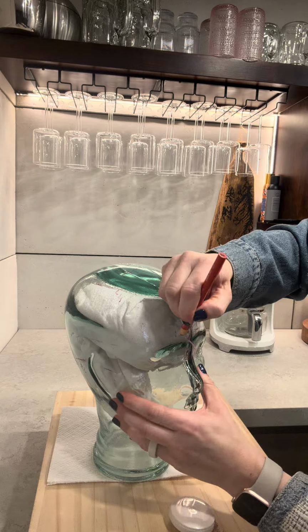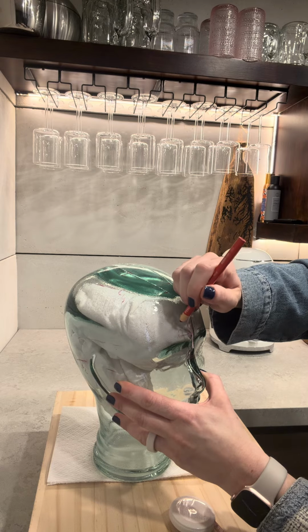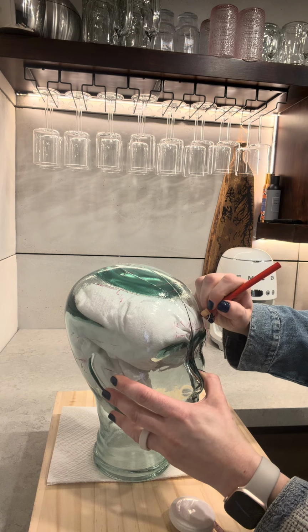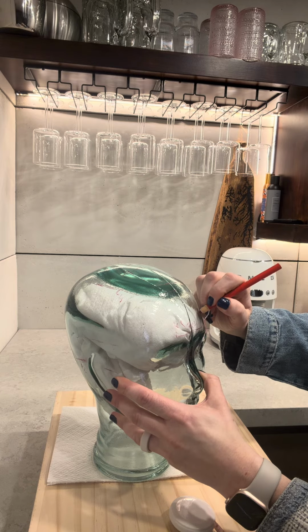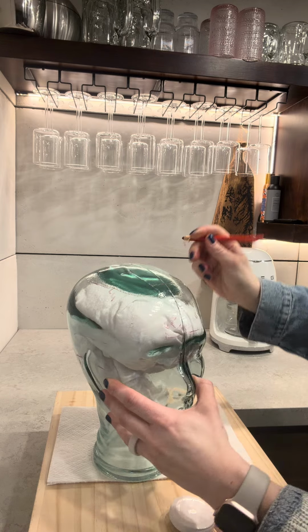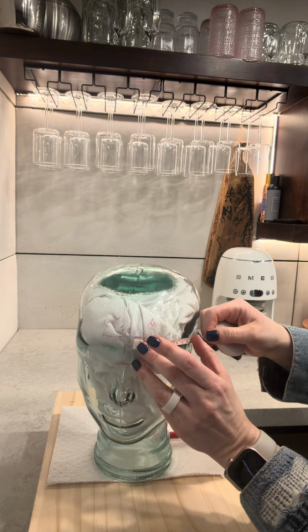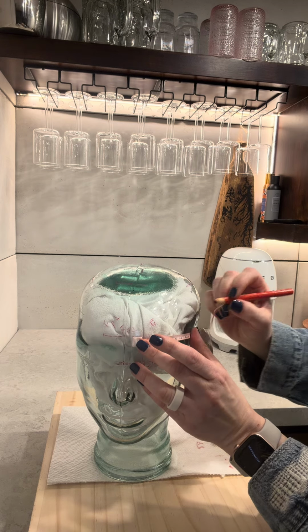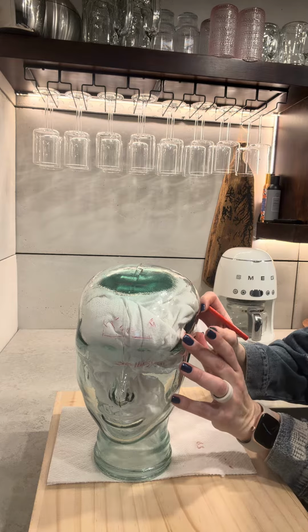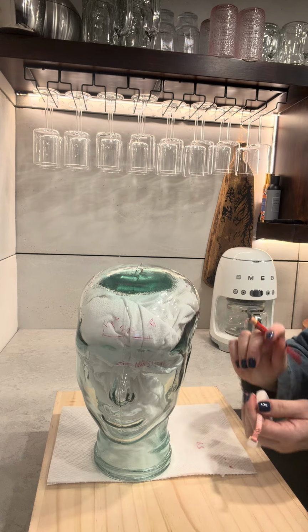That's my 10% here. And we have true Fp1 and Fp2. Okay, now I'm gonna go ahead and measure 10%, 5.9. 5.9.